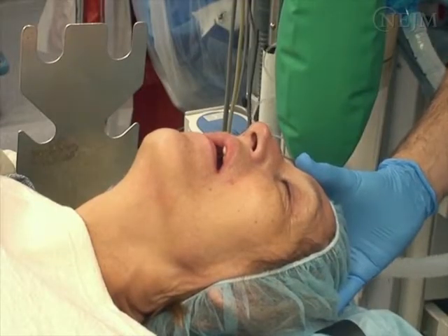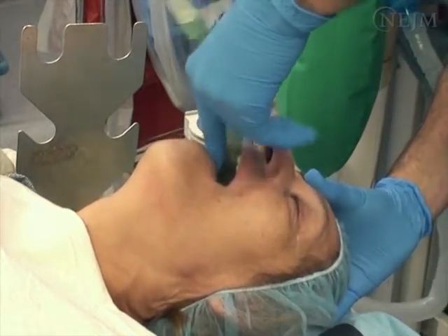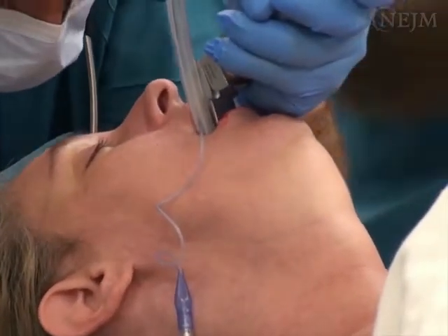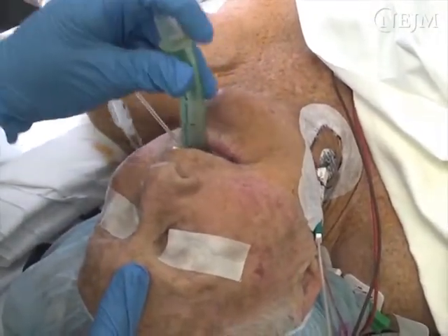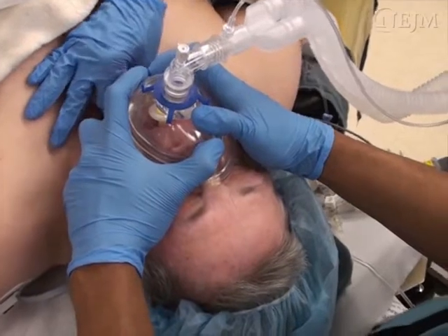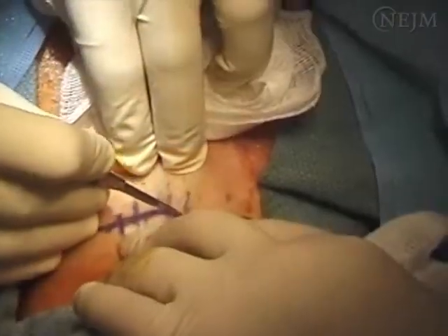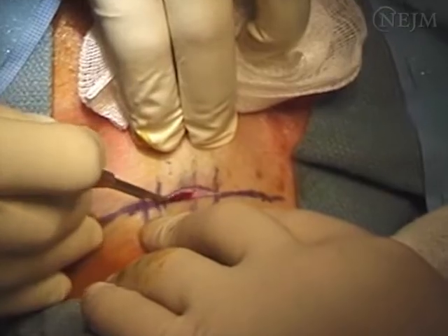Some experts recommend having other advanced airway tools on hand before performing endotracheal extubation. These include supraglottic rescue devices, airway exchange catheters, and a video laryngoscope. If ventilation with a face mask or reintubation is difficult, a supraglottic rescue device such as a laryngeal mask airway may allow adequate oxygenation and ventilation. In the rare event that it is not possible to ventilate or reintubate the patient after extubation, it may be necessary to establish emergency airway access by performing a cricothyroidotomy. You should make sure that the equipment and personnel needed to perform a cricothyroidotomy are available.